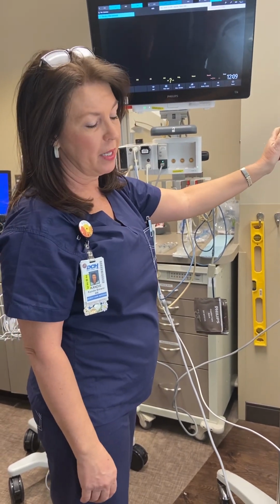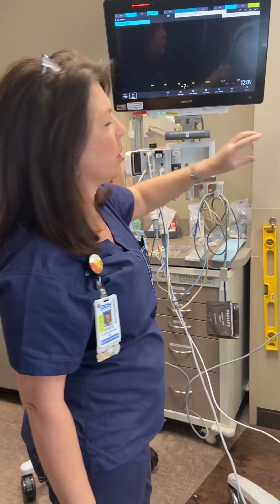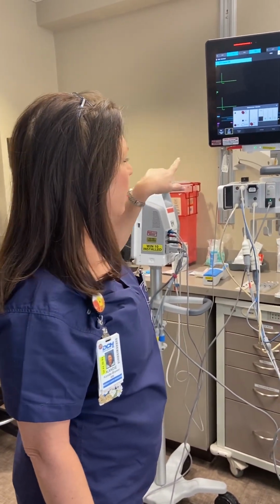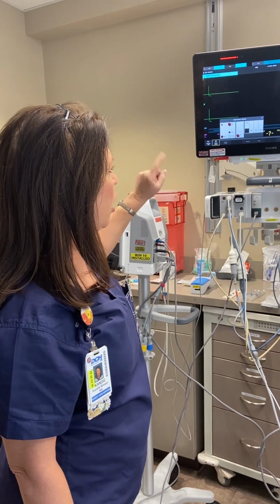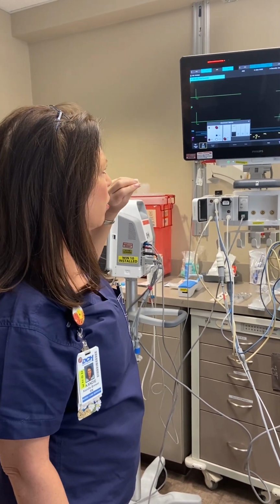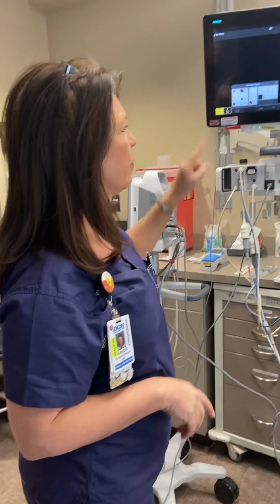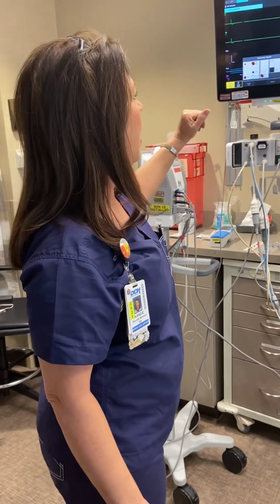So with that being said, first of all, you're just going to take a note of what your vitals are. Your QRS tone on the monitor should always be on, because there's lots of people in the room when the admission takes place. So you need to be listening for the QRS tone in the sense of when there is a change.